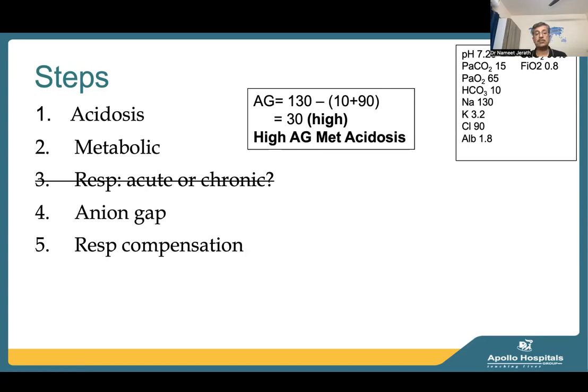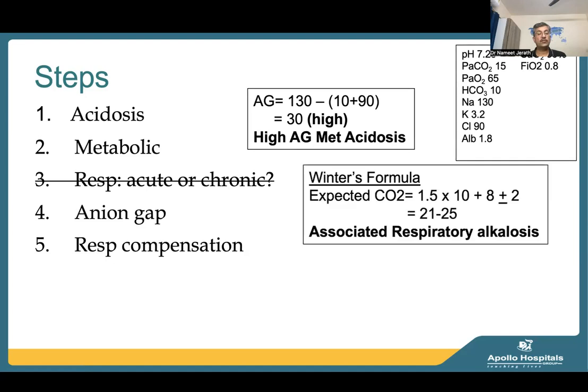So what's the next step? Now we need to find out the respiratory compensation to this metabolic acidosis. Is this adequate or not? And for this, we use the Winter's formula.